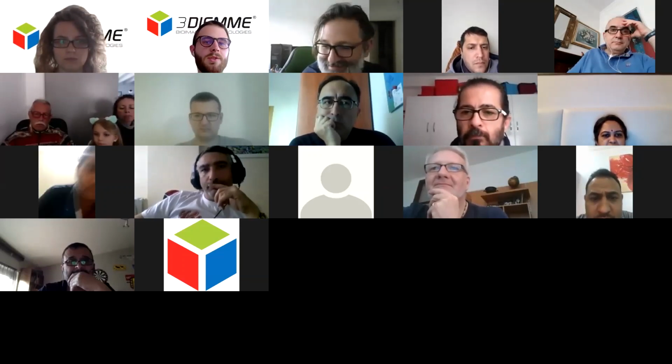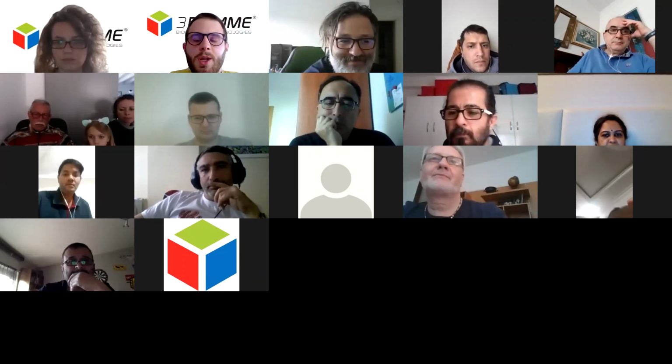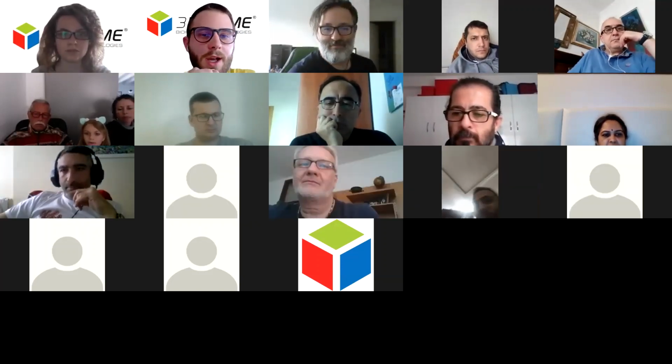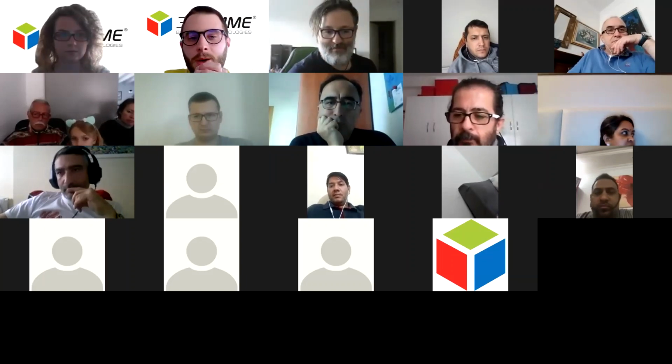My name is Luca, and I am one of the 3DM biomedical engineers. Today we'll show you our RealGUIDE Software Suite. We will explain all the different types of modules that RealGUIDE has, and we'll show you how these modules work. And then I show to you with my colleagues.